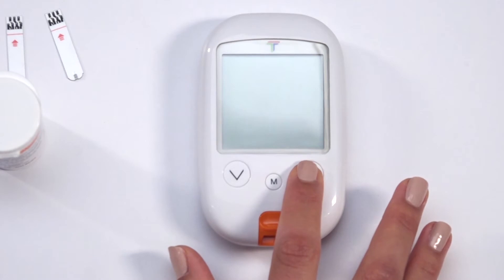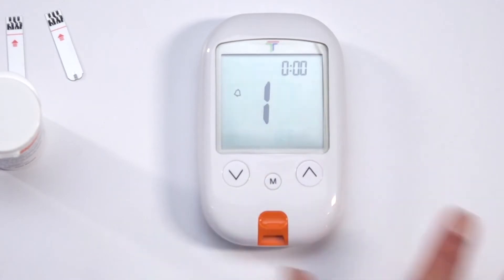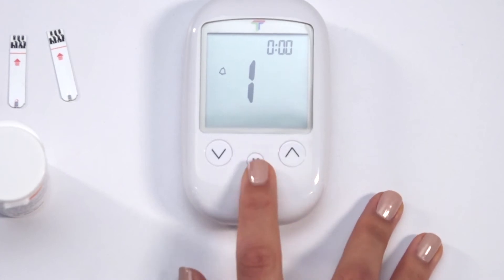To set up your reminder alarms, press and hold the up arrow button for at least four seconds while the meter is off. The first reminder alarm will flash on the screen. Use the arrows to turn the alarm on or off and press M to confirm.